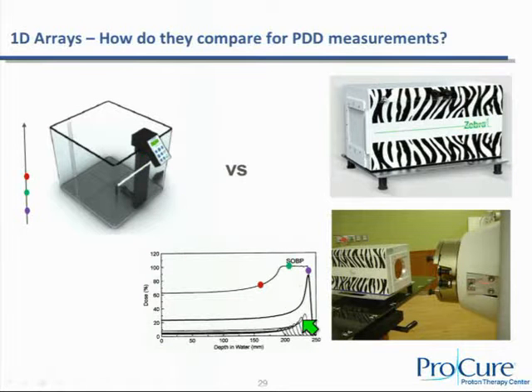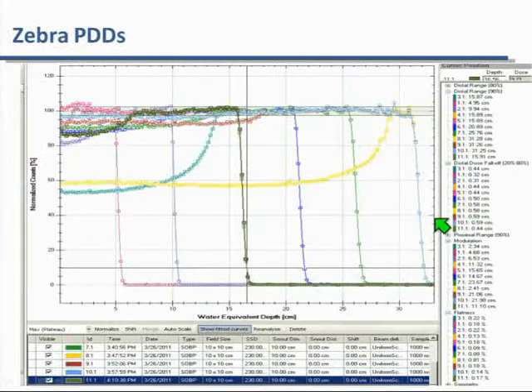Uniform scanning, we're not that lucky, because the delivery is layer by layer, so you don't have this entire area delivered at once, so the detector is not covered by those at any given point the same way every time. So after a certain delivery, the detector is not detecting anything. So it's very slow, and it's impossible to do a meaningful PDD in uniform scanning, so we need a device like that.